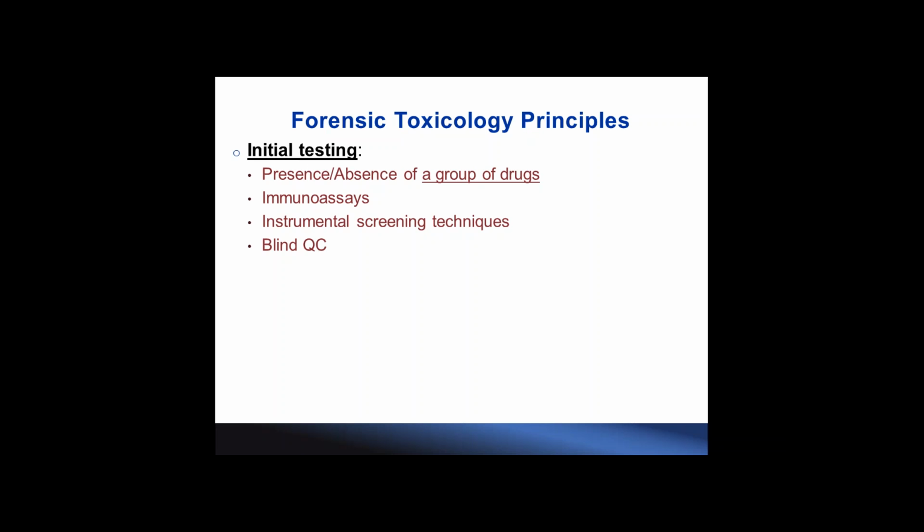So the next principle is regarding testing. At least two stages of testing must be done. At first, it's initial, or so-called screening, testing for the presence or absence of a group of drugs. It is a non-specific term. It's generally done by immunoassays, and if the kits are not available, the instrumental screening techniques can be set up.